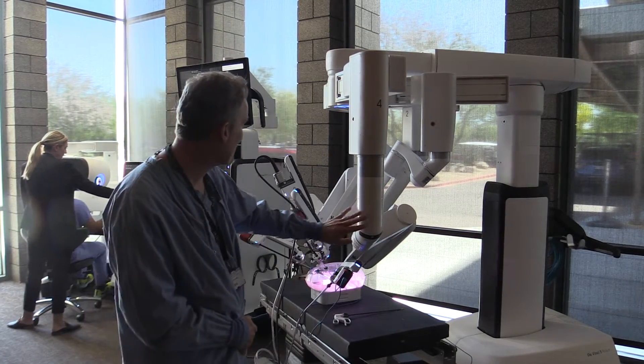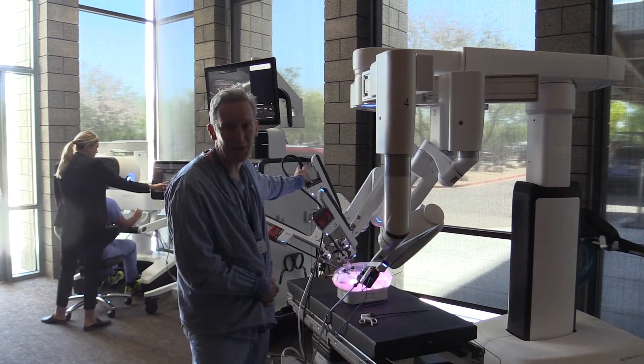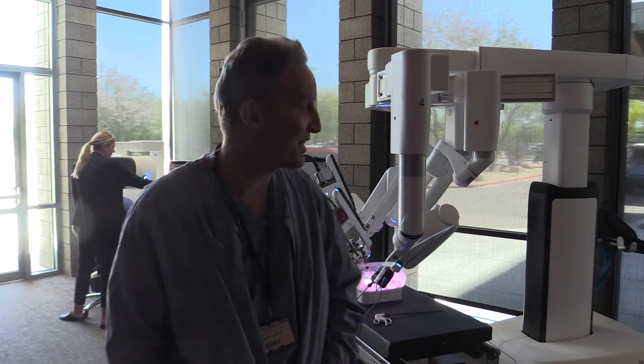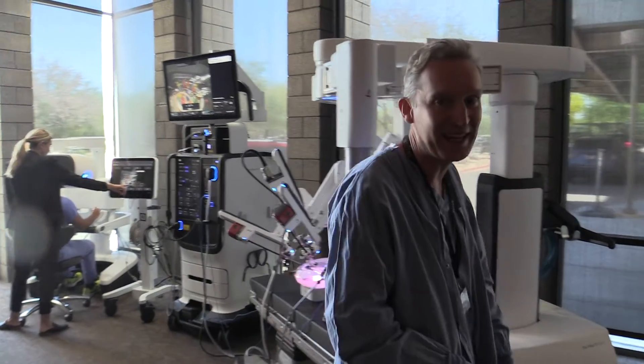Even though it looks fairly similar, you've got a warmer on the camera, you've got force feedback in six of the instruments. And come and look at the console over here.